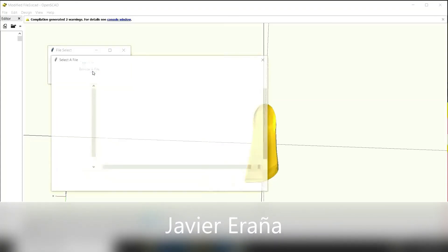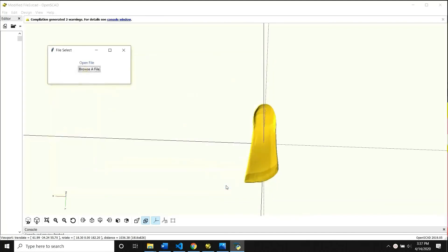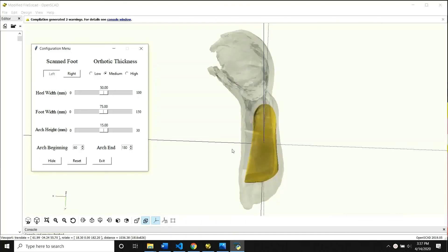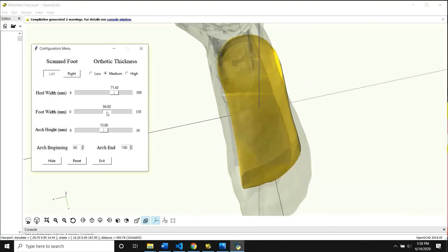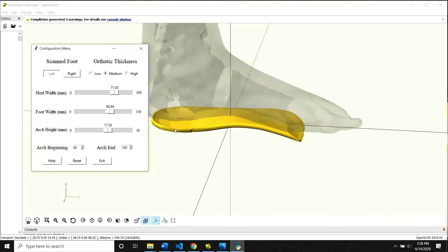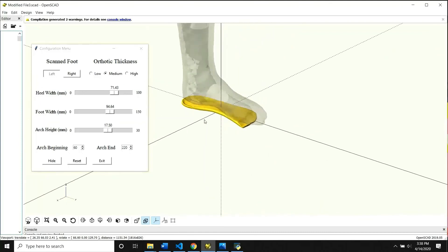This is the front end of our graphical user interface. It gives you the option to open a scanned file, and doing so opens a configuration menu and a pre-generated neutral orthotic. You can use the patient's scanned foot to adjust the orthotic to their specific needs. The configuration menu allows you to adjust the orthotic in many ways — for example, you can select the right or left foot and show the scanned foot width to compare and adjust the orthotic. You can change characteristics such as orthotic thickness; in this clip we have chosen medium thickness. It also allows you to change the heel width, foot width, and arch height, with measurements in millimeters adjusted by moving a slider. These sliders were implemented for very accurate and detailed adjustment. It also allows you to change where the arch begins and ends, effectively customizing the entire contour of the orthotic to produce a fully customizable, patient-specific orthotic.